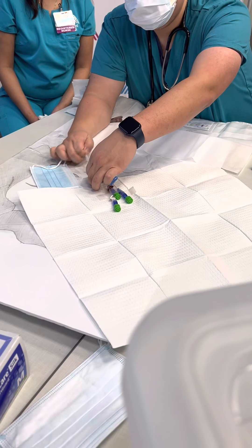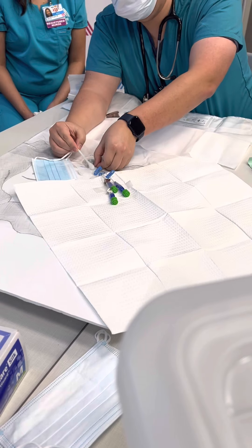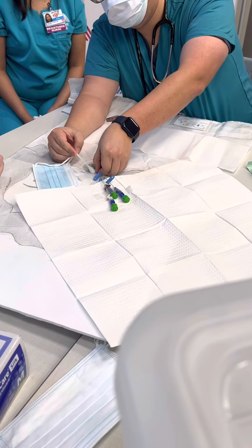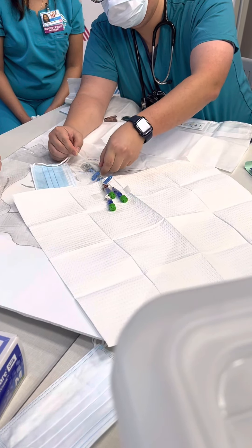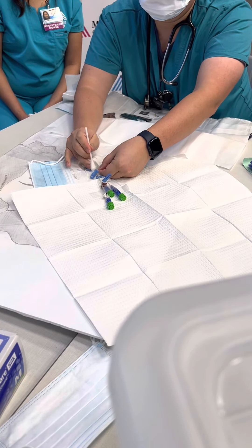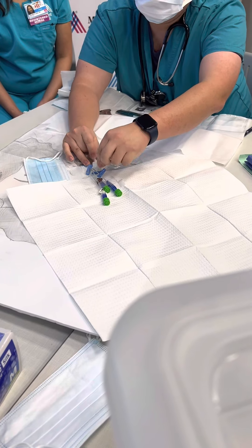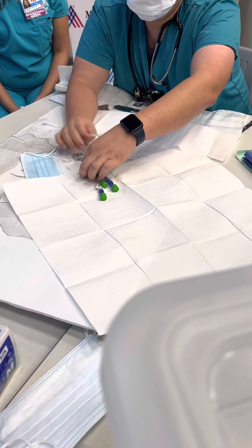Go ahead and remove the dressing — beautiful technique. If using scissors helps you, then use scissors, just be mindful of the catheter.